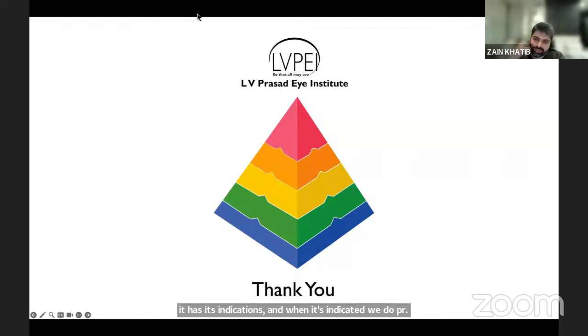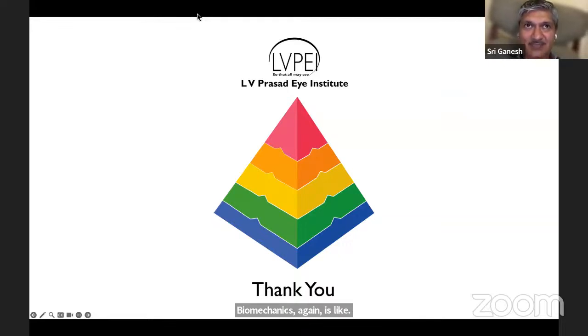Sir, any role of biomechanics in your practice as a screening tool? Biomechanics, again, is like wavefront aberrometry. It's nice to talk about, it's nice to do research on, but reproducibility is not that great. Of course, in those borderline very early cases, it's like being on the fence. You don't know whether it's a weak cornea or whether it is not. Of course, if there is keratoconus, then definitely it shows that the cornea is weaker. So I think biomechanics has not progressed to that extent where we can use it as a clinical tool in day-to-day practice. It's okay as a research tool, but I would not take it at face value because repeatability also is not that good.